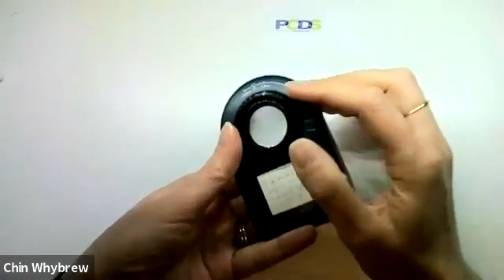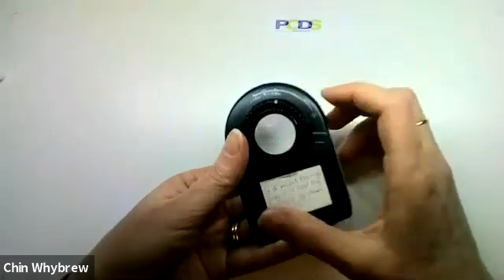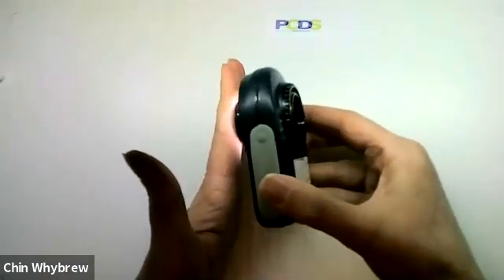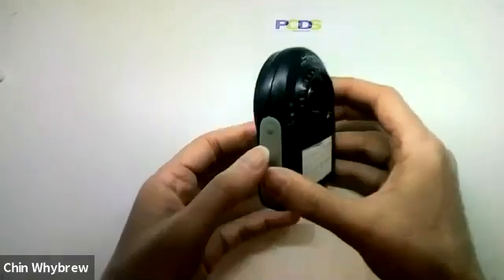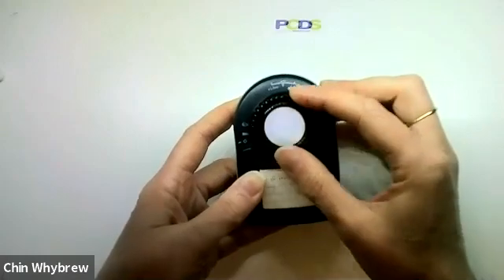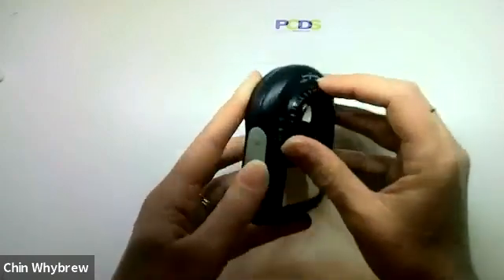If you take it out to less than minus one millimetre like this, when you touch it on the skin, it will just go back in. And that was a problem that people had a lot with these at the beginning when they didn't realise that that was what that was for.